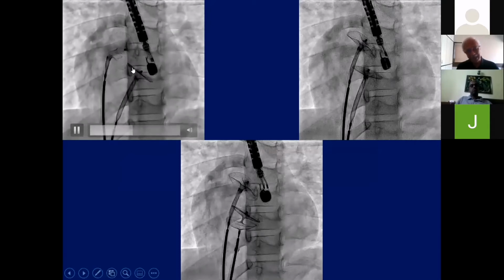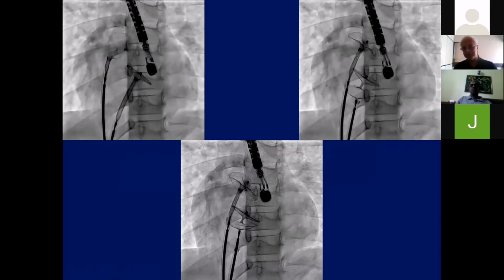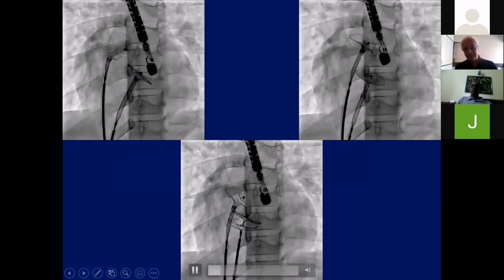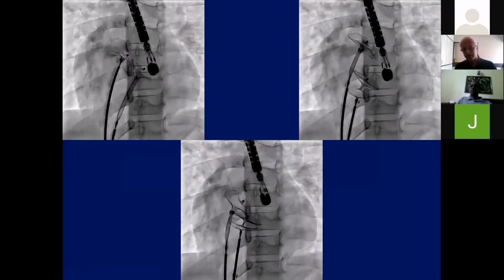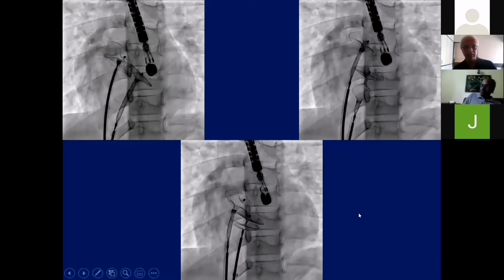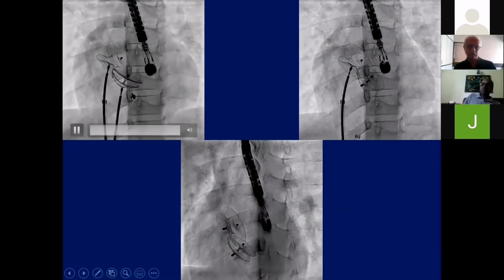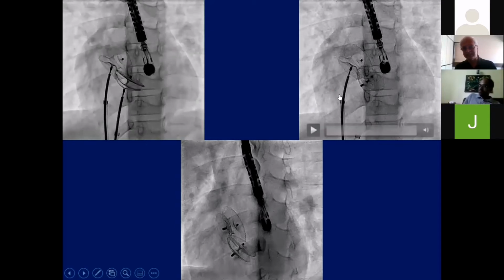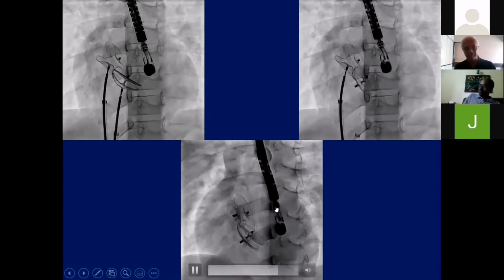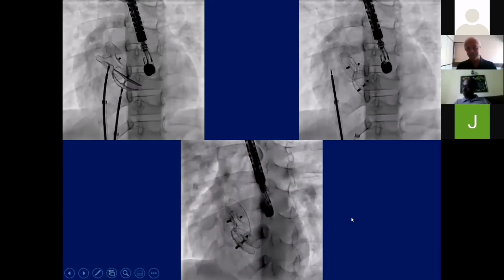So you need to recapture this, get the fenestrated device in its position and deliver the fenestrated device, and then go ahead and get the septal occluder on top of the fenestrated device and close the fossa ovalis defect, as is seen here. So in the same patient, we have closed the fossa ovalis defect with a septal occluder and multiple fenestrations in septum primum by using a fenestrated device.